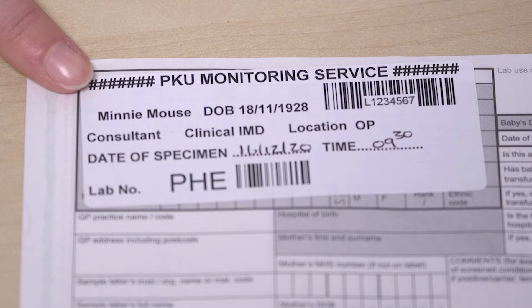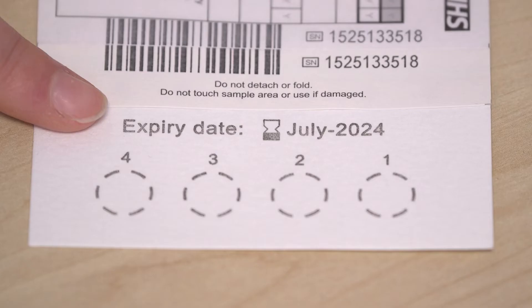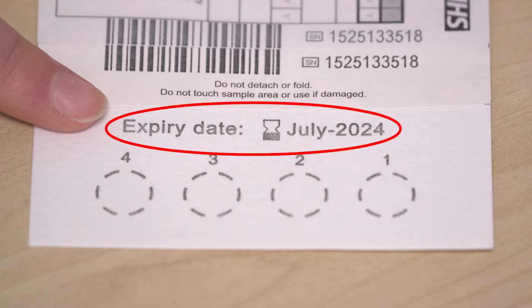Use the stickers that the hospital have provided for you on the card. Make sure the stickers have the correct name and date of birth of your child on them. Make sure that the blood spot card is in date and valid to use. The expiry date is on the end of the card.